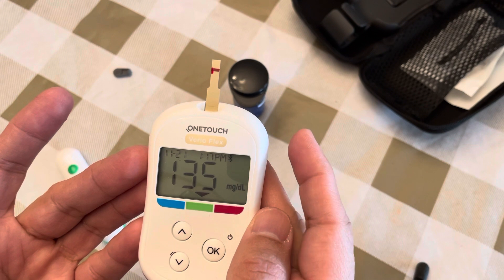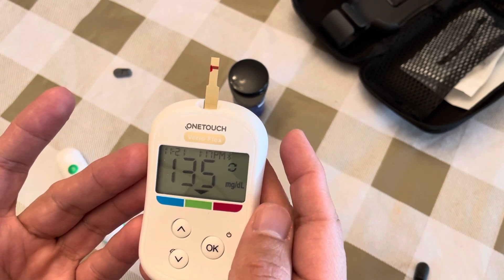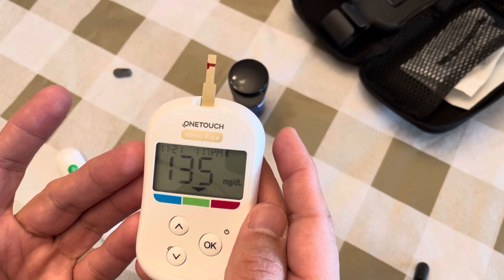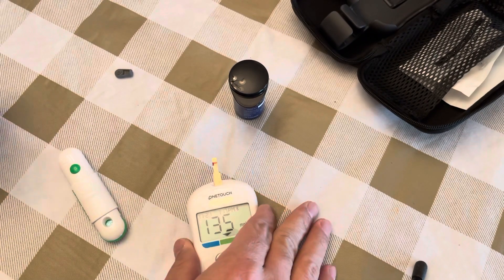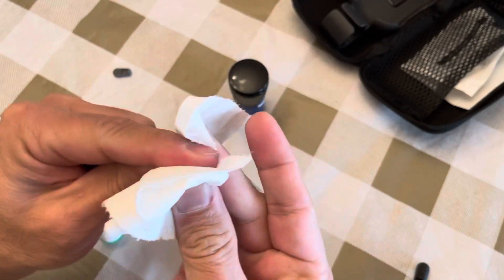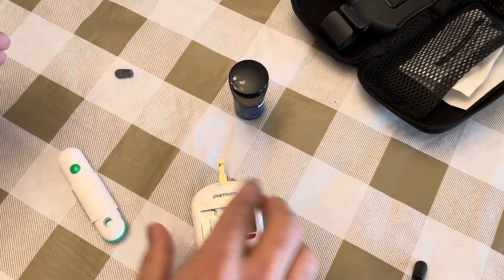There's a Bluetooth icon on the meter, so it can sync with your cell phone. I downloaded the app to transfer this information to my phone, though I'm recording on the same phone so I can't show that part. Once you're done, set the meter down and wash your finger.